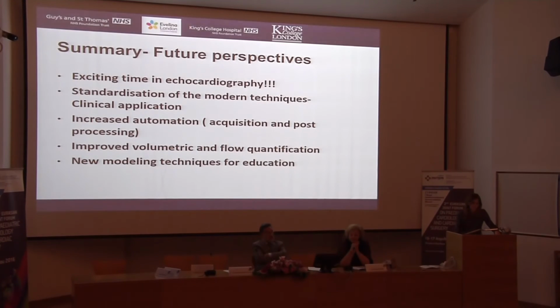So in summary, I hope that I have convinced you that we are facing an exciting time in echocardiography. We have a number of modern techniques that we can use in order to assess accurately the cardiac anatomy, the function, and also the hemodynamics. Of course, most of them are still used for research purposes, but hopefully with better standardization, increased automation, and improved volumetric and flow quantification, the clinical use will not be far.